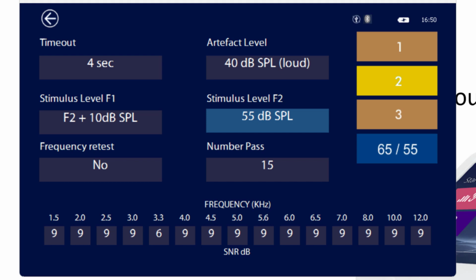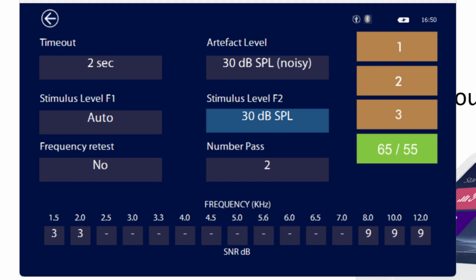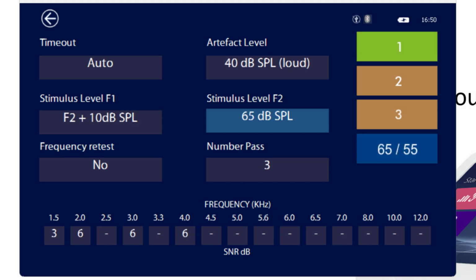I am not really using my third protocol for anything, but you can freely change it. There is also this 65-55 protocol that fixes all the settings here, and it doesn't really allow you to change anything at all. I would ignore that. I'm actually not sure why it's there. Maybe we use it in production, but then we don't want to take it off. But use protocol 1 and 2, maybe number 3 in case there is some special needs for your demonstrations.